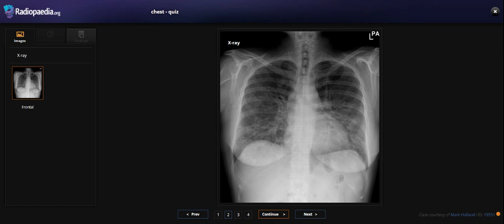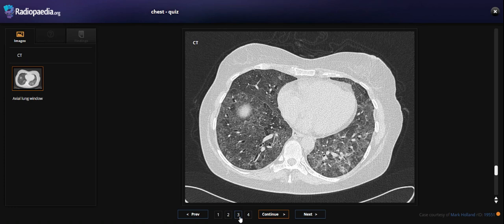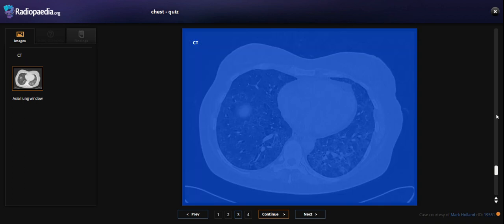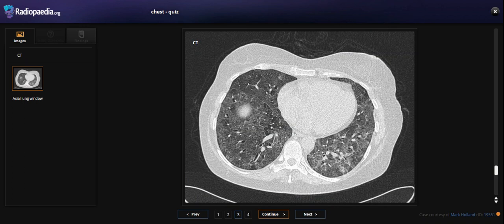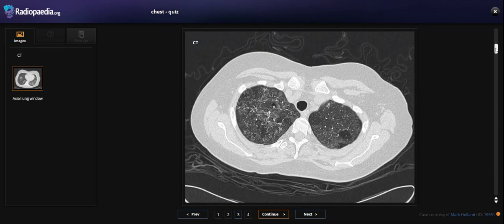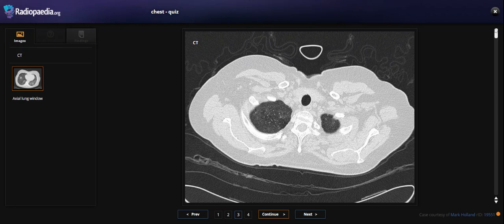So what do we do next? In this case, she got a chest CT. Let's scroll down from the apex.